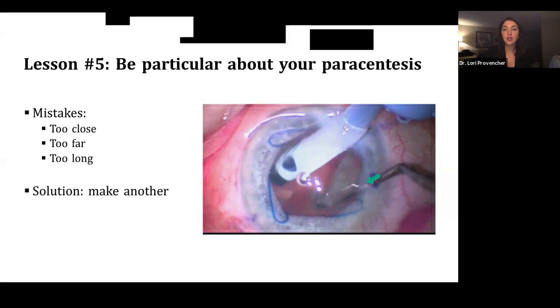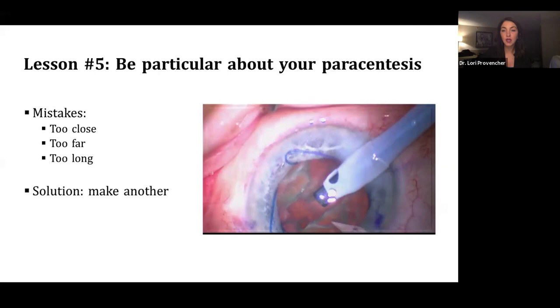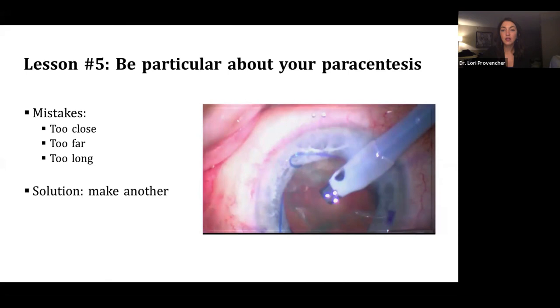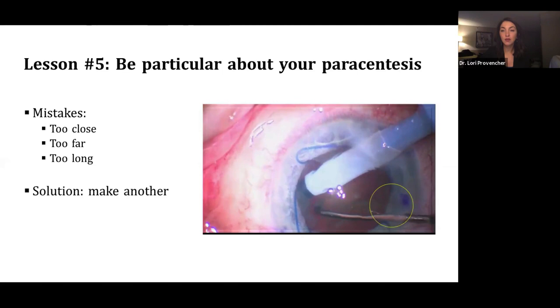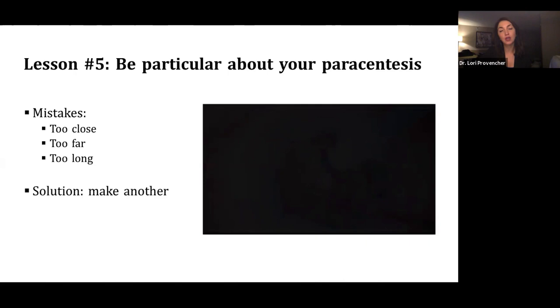You'll see in this video here that I'm getting some corneal distortion as I'm trying to crack the lens. I'm also having a lot of trouble rotating the lens, and I'm probably stressing the zonules more than necessary because of my poor para placement. And I finally just get fed up and realize what's going on. So I take my second instrument out, make another para. But it makes a world of difference. And I've circled for you that I really only moved the para about one millimeter, and it made a huge difference.